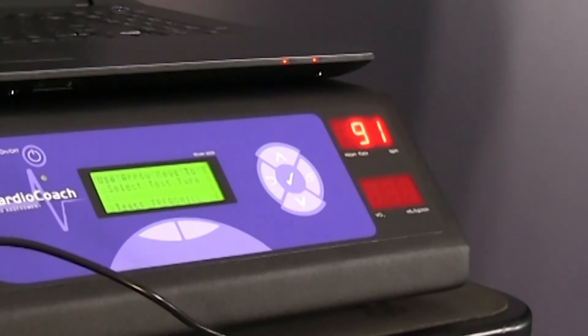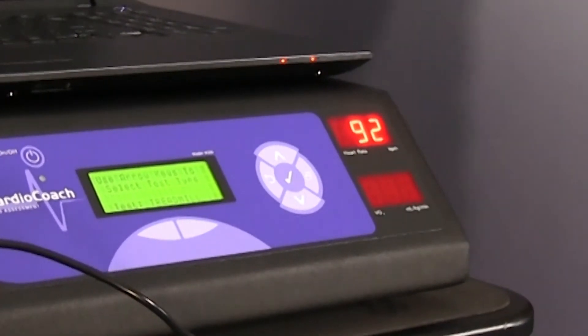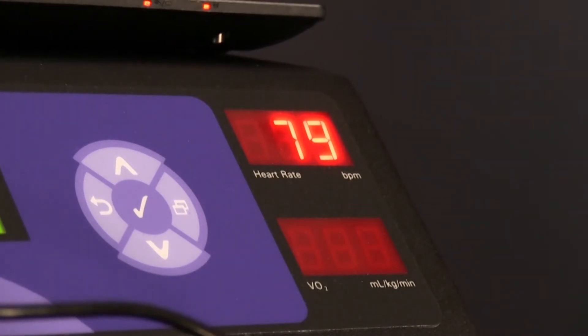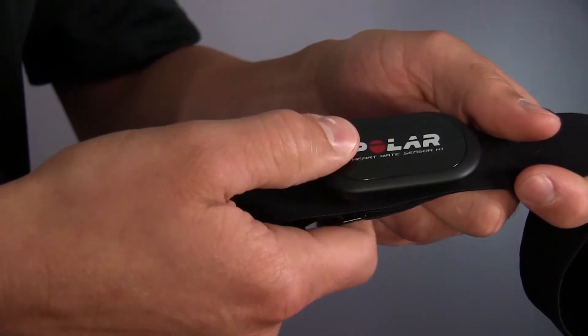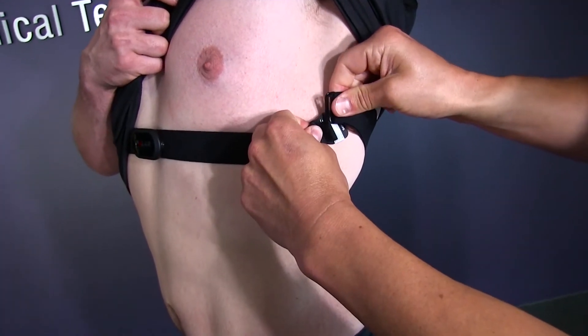To make sure the heart rate strap is working properly, look at the red numeric LED display and see if the client's heart rate appears. Do not begin the test until a valid heart rate is being displayed on the CardioCoach. If the heart rate signal is not steady, adjust the placement of the strap and make sure the pickup is in close proximity to the client. If it continues to be unreliable, the battery of your Polar heart rate strap may have expired. New heart rate straps can be ordered from Core's website at core.com.